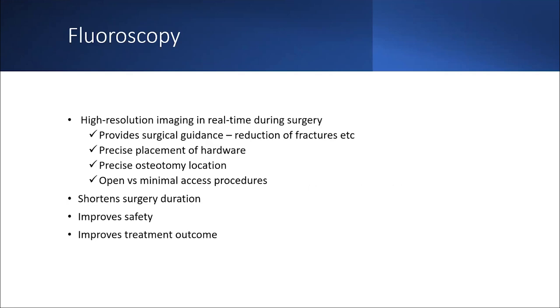So fluoroscopy essentially allows high resolution imaging in real time during surgery, and the advantage of this is it allows precision. You're able to locate the site of your osteotomy, place implants in the exact location where you want them, and achieve reduction of fragments or fractures appropriately. It also allows you to do major surgery from a minimal access perspective rather than open surgery. Of course, the consequence of this is duration of surgery is reduced. There is improvement in safety and improvement in overall treatment outcome.